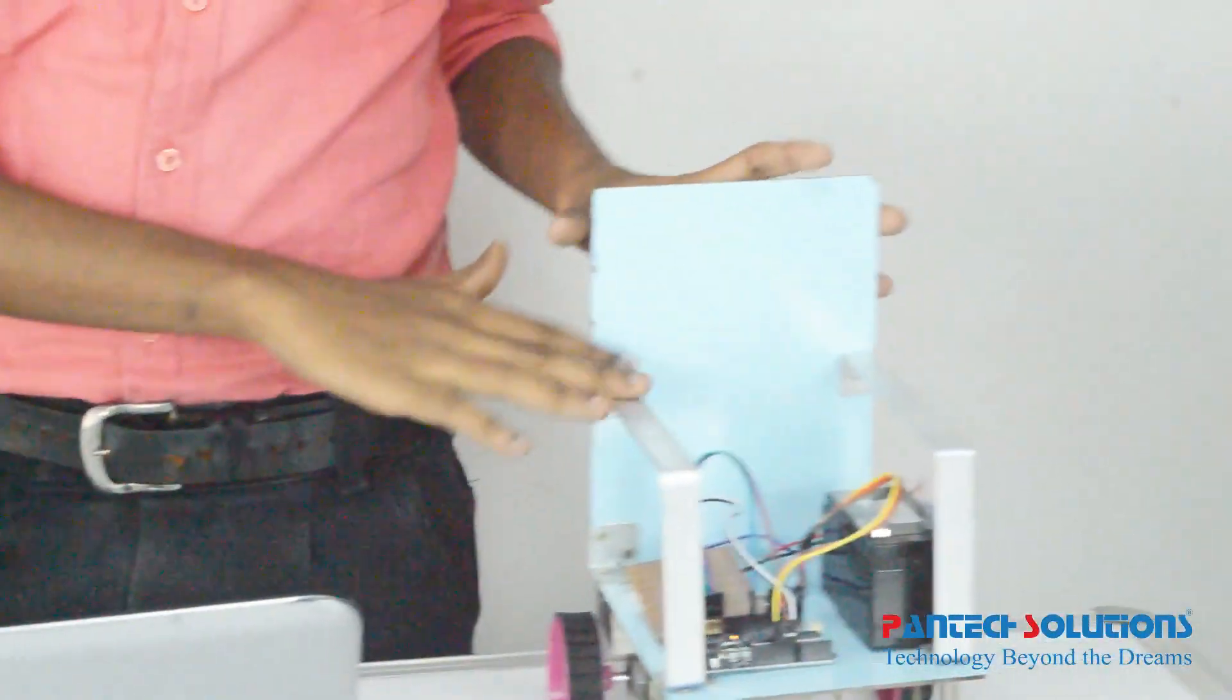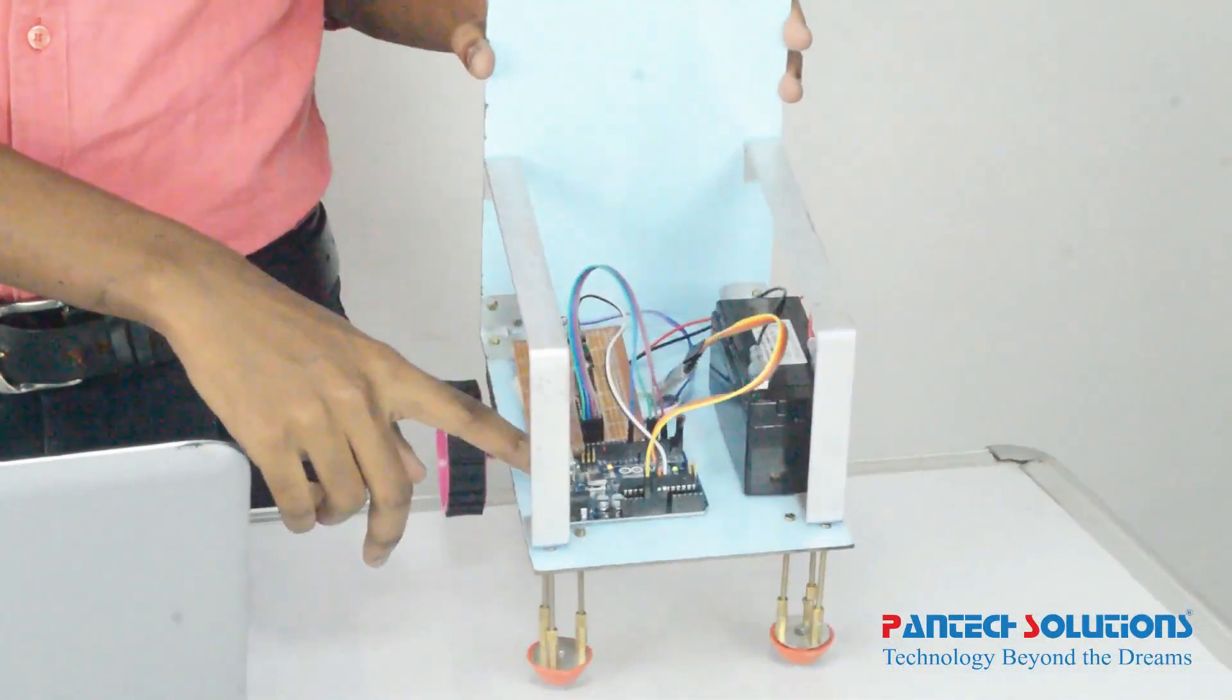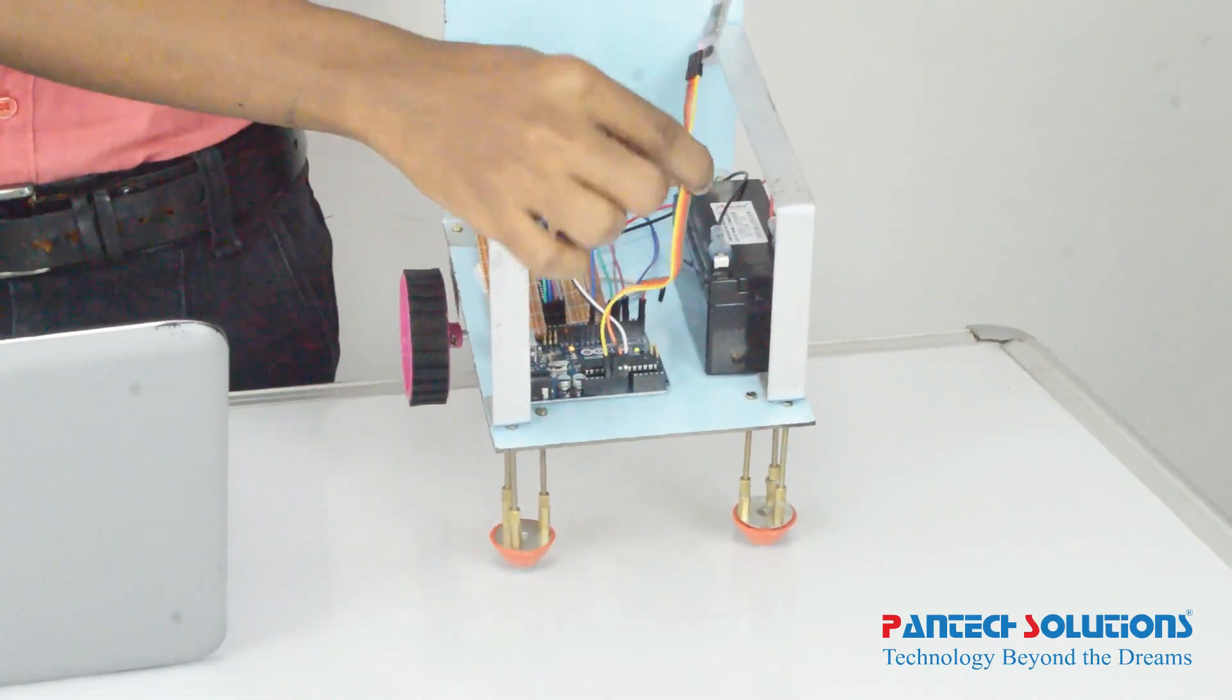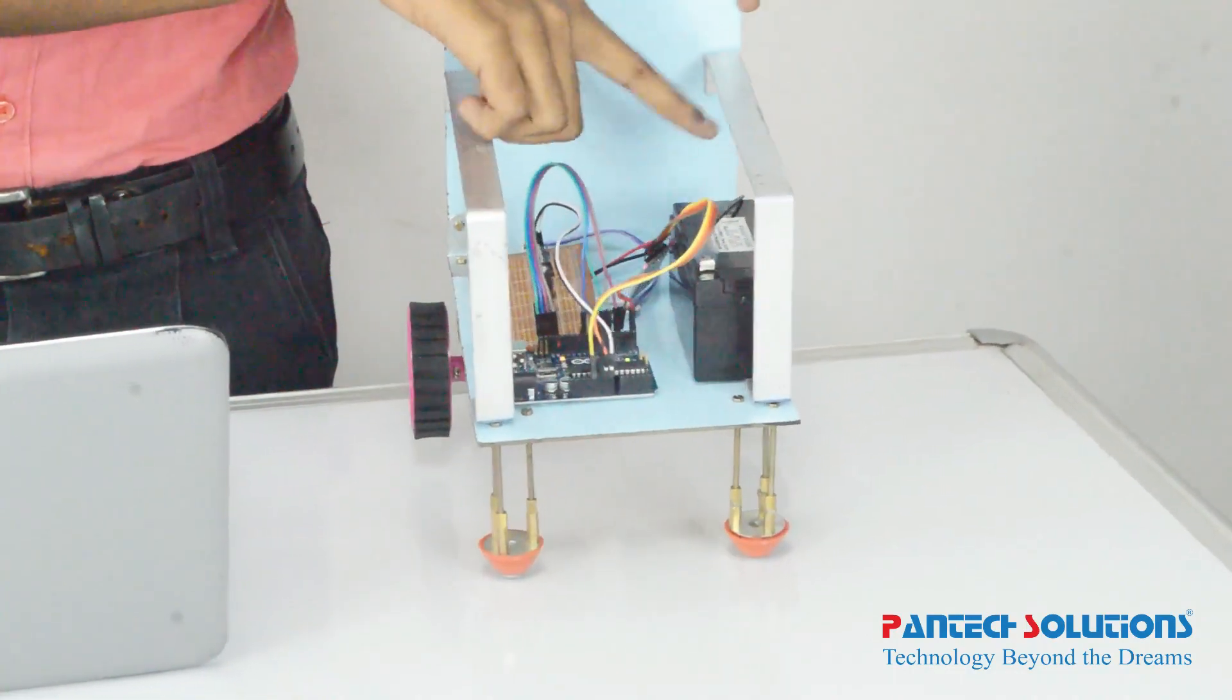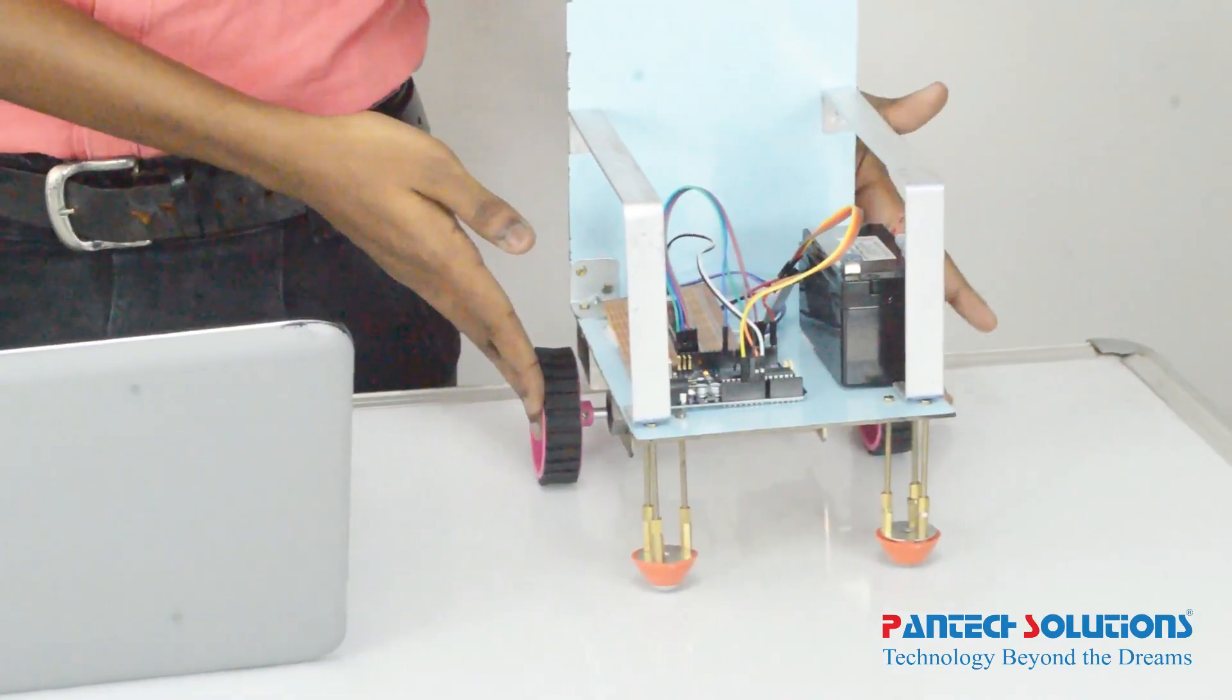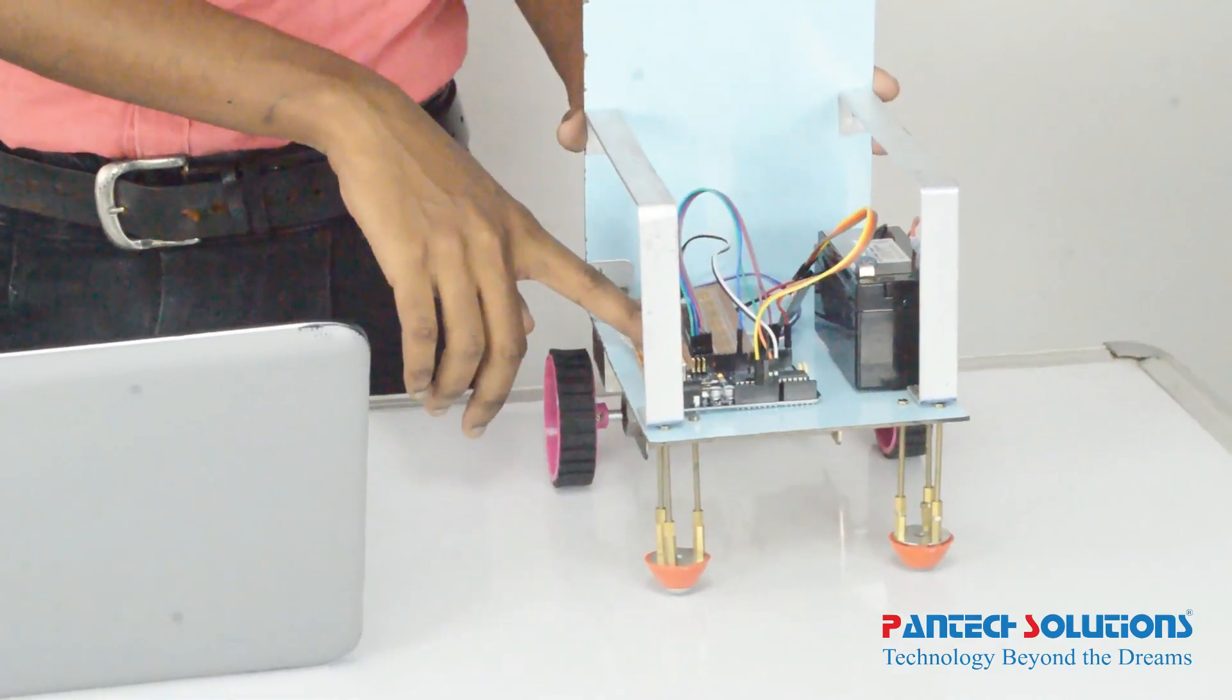So before that, here this is a miniature wheelchair which contains an Arduino microcontroller, which will make it a wireless electric computer. For power supply, I am using a battery. This miniature wheelchair contains two motors. Here it contains a motor driver IC.